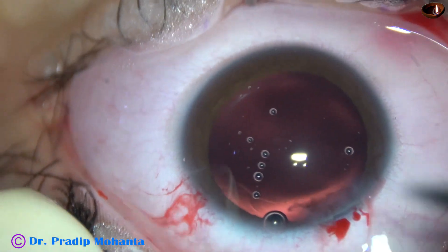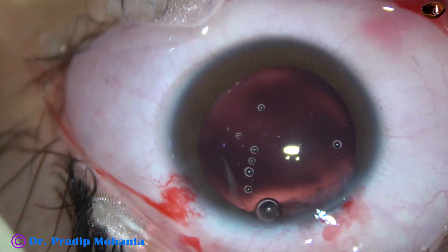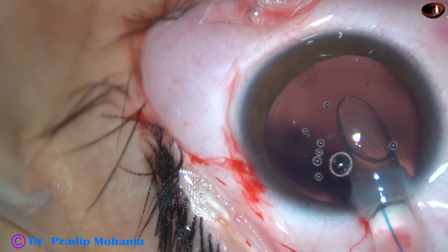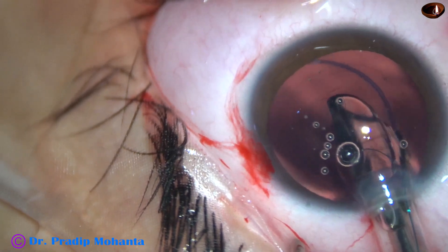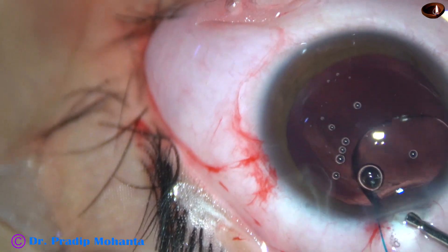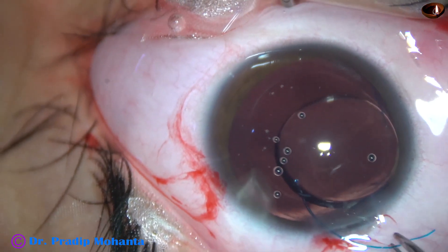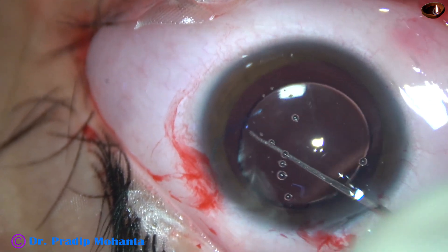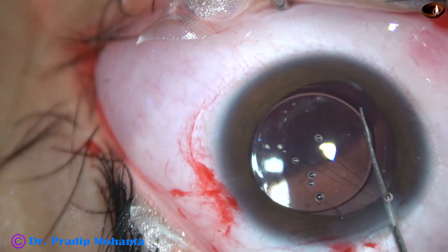The IOL cartridge I'm going to use will not go through the 2.8 millimeter wound, so I enlarge the wound to about 3.1 millimeters. Here goes the cartridge — the leading haptic is going into the capsular bag. This is a multi-piece intraocular lens. Now the trailing haptic has gone over the iris.